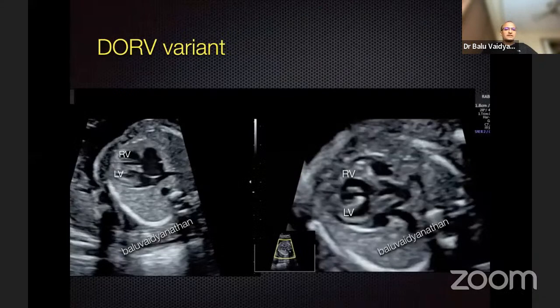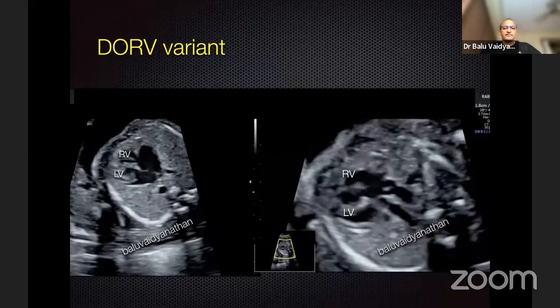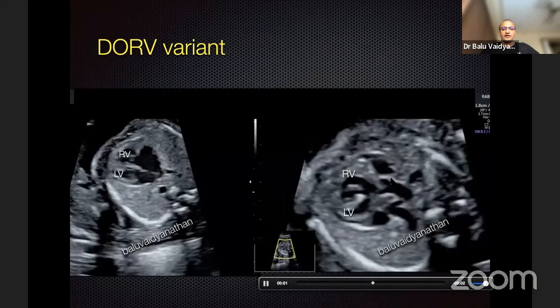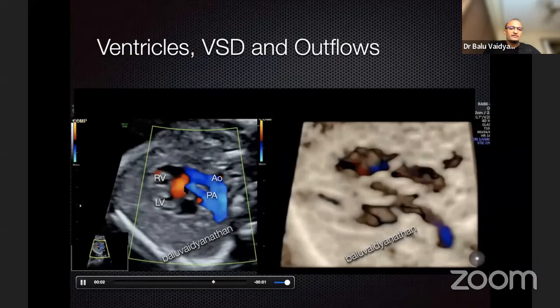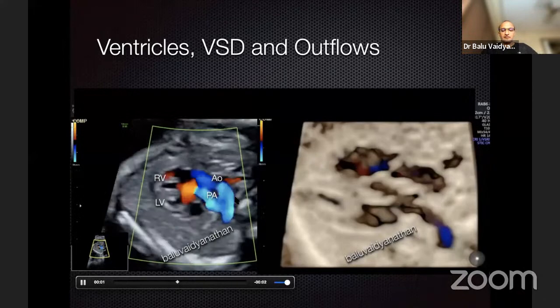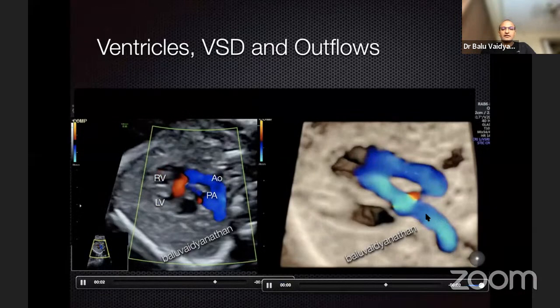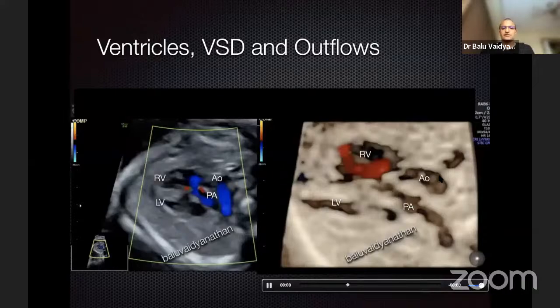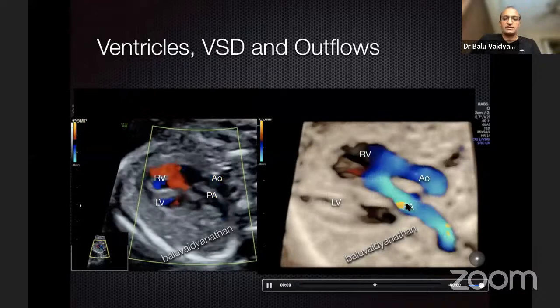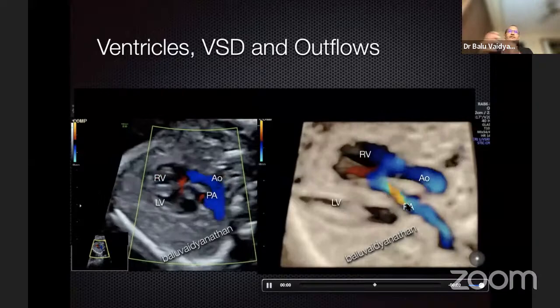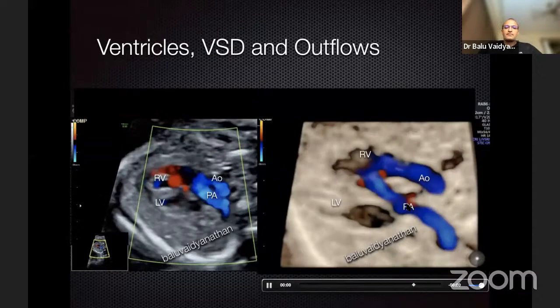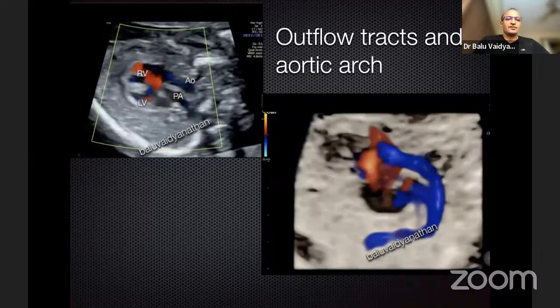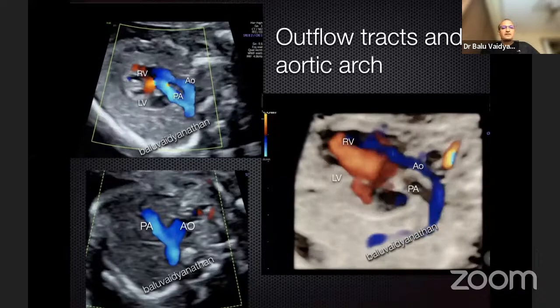The other types of DORV: we saw the classical TOF type. In another type, you see balanced ventricles and both outflows arising from the right ventricle. When we put color, you see the red flow showing the VSD and both the aorta and PA arising from the right ventricle. We can very clearly see the double outlet origin of the right ventricle. The more anterior outflow is not dividing while the more posterior outflow is bifurcating — so the anterior outflow is the aorta and the posterior outflow is the PA, meaning the great arteries are transposed. This is what we call the TGA type of DORV.